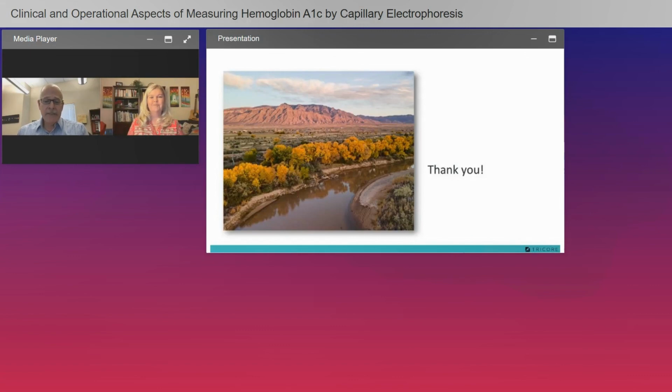Thanks for the attention and your interest in the presentation. Our journey with hemoglobin A1c testing has been pretty steady for many years until we made this switch. But the laboratory is very happy with the instruments and the method that we've chosen. And I have a lot of confidence in the results that we report. And I really am pleased that we're able to identify patients who have hemoglobin variants, yet still, in nearly all cases we've encountered, able to report an accurate A1c, with the caveat that in homozygous patients there's no hemoglobin A, but there's the risk of decreased red blood cell lifespan and therefore an effect on the A1c result. So those are my final comments.